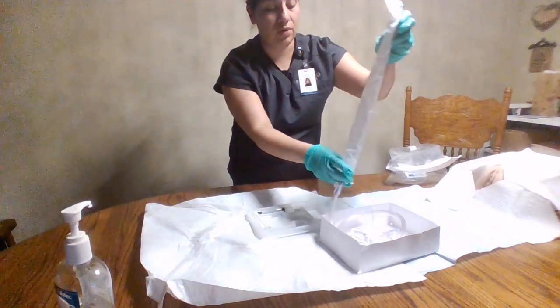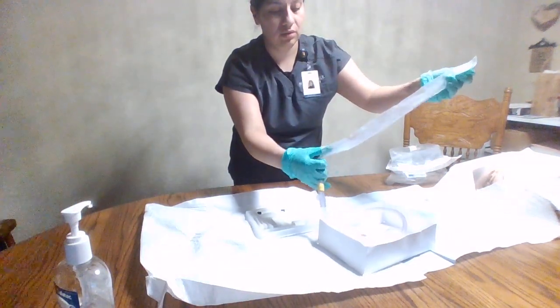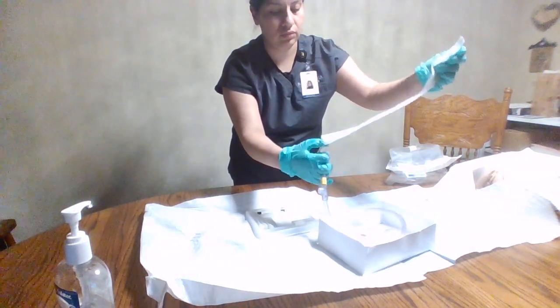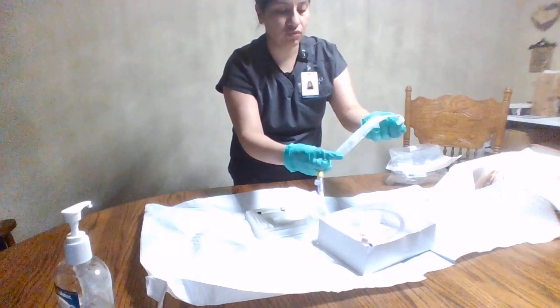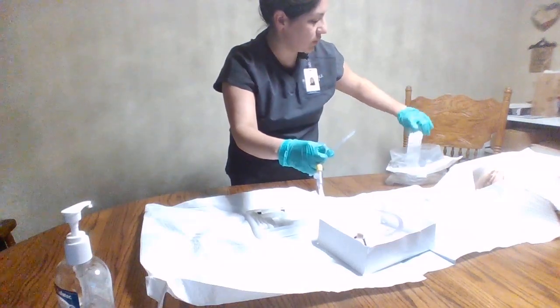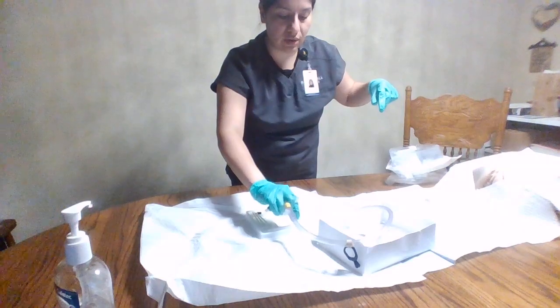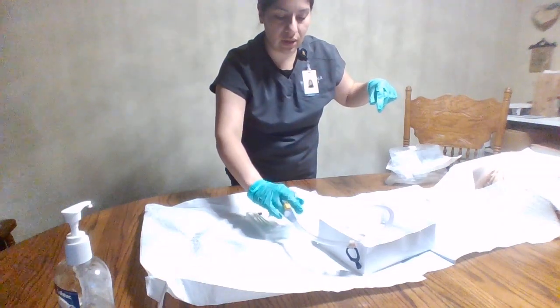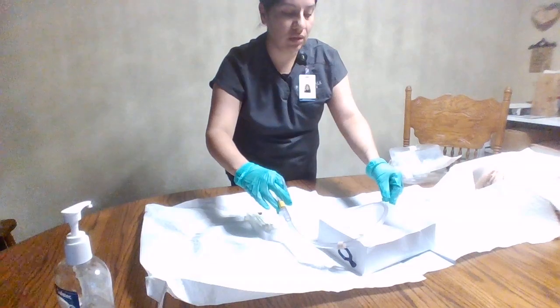And I will go ahead and grab the catheter, removing the cover. And then with the catheter, I will go ahead and dispose of the cover. And I will place the catheter in the lubricant that I have exposed.